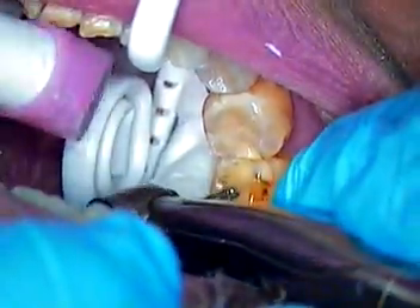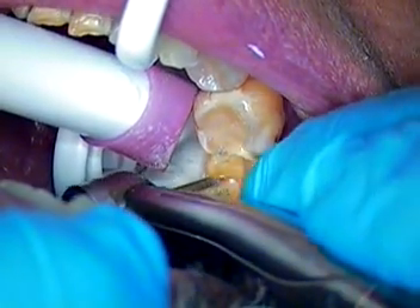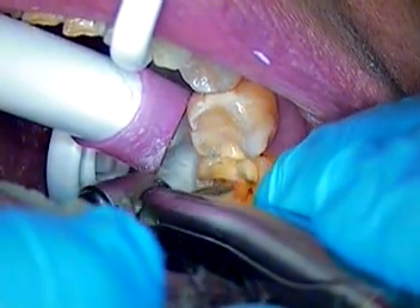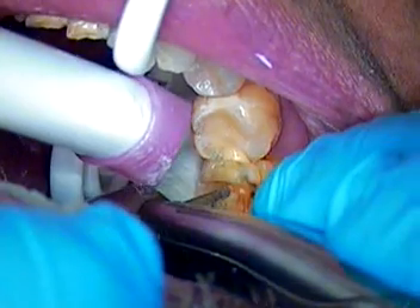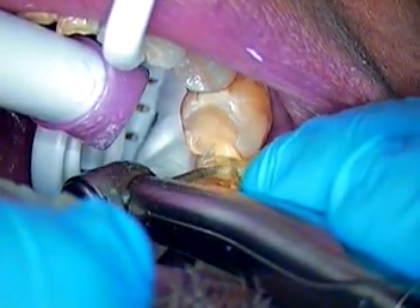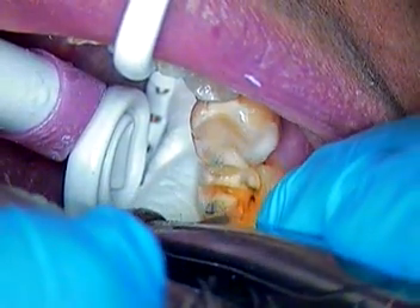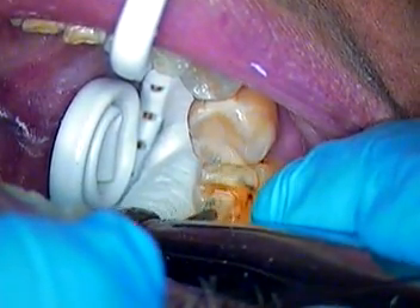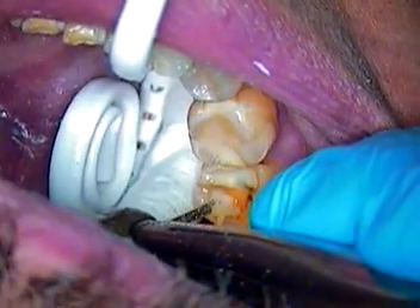So now I'm going to prep the lingual. Again, I'm going to the depth diameter of the toe of the burr itself and doing my depth cuts. Small suction if you can. And we're switching from a large suction to something called a tippadilly.